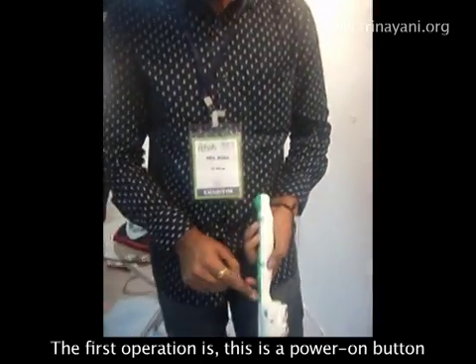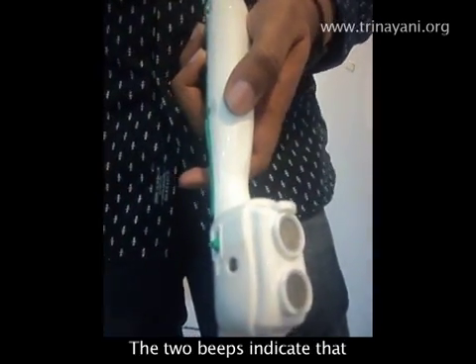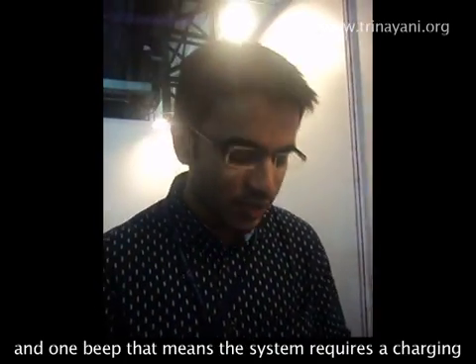The first operation: this is the power on button — from here you can power it on. It provides two beeps to indicate the system is charged around 40 to 70 percent. If it provides three beeps, that means the system is fully charged. One beep means the system requires charging.